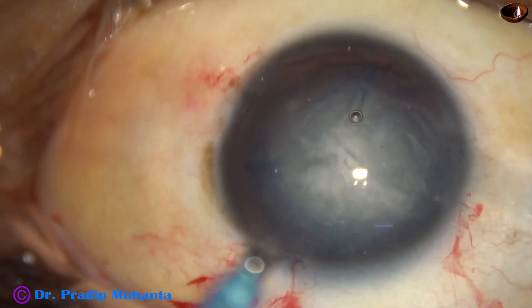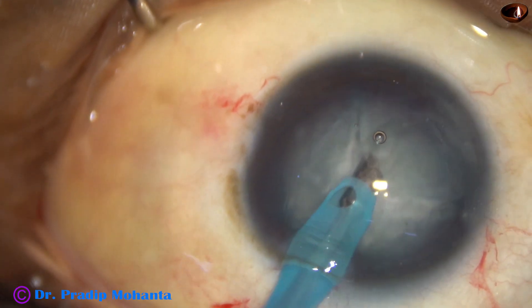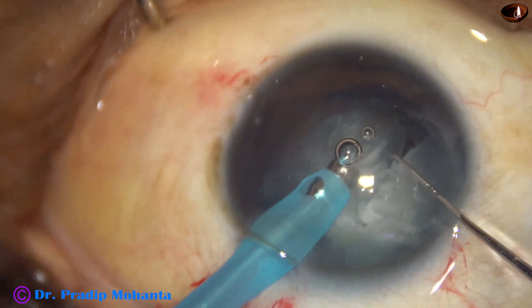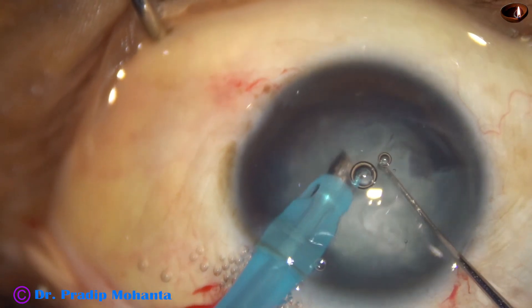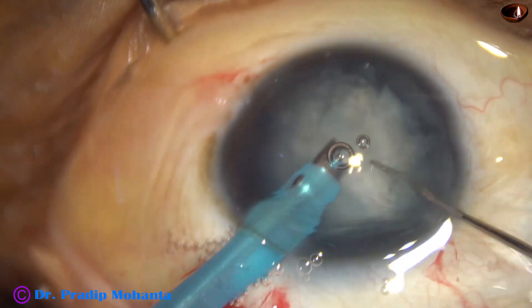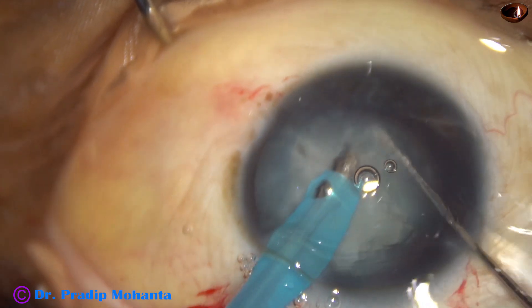Now, I inject visco and then introduce the phaco handpiece. I am a right-handed person, but I have some practice doing surgery with my left hand — I trained my left hand for some time. That is why I could do this case with my left hand. It is not the first time I am trying this; in routine cases, I have practiced phacoemulsification with my non-dominant hand.